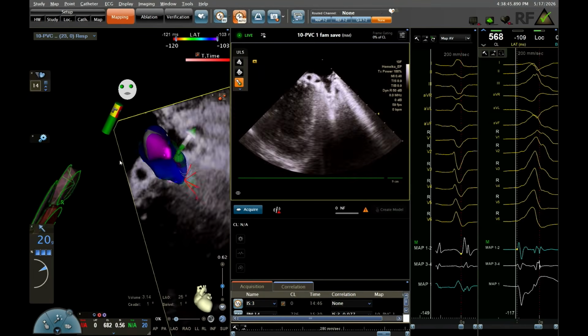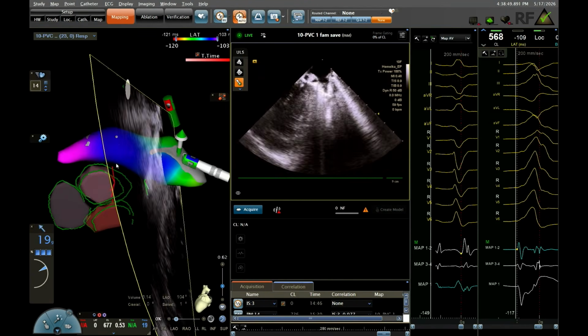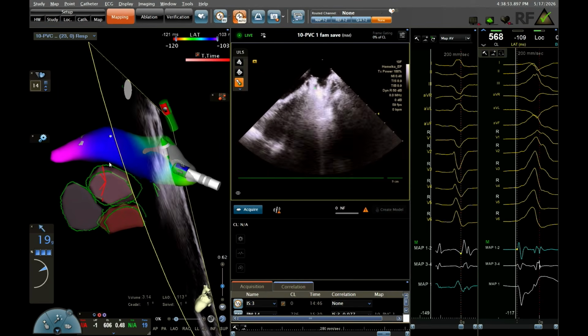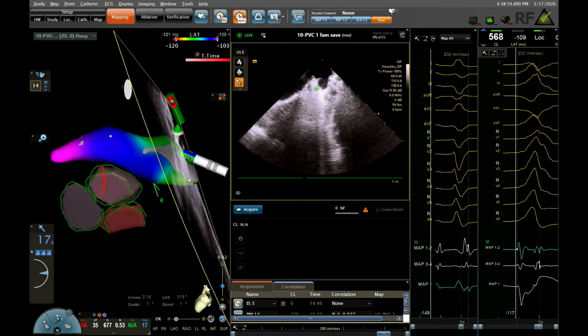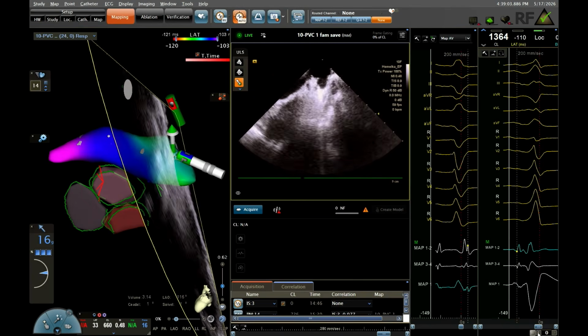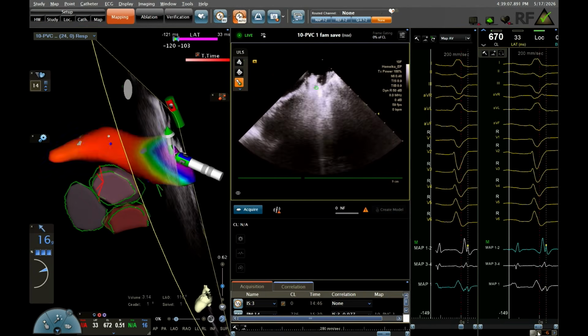Okay? Move it around so I can see where it is. Yeah, I'm too interior, so I'm going to come slowly. Once you caught the green marker, you see that? That's the green marker, and that's the circumflex. I can tell you we are almost a centimeter from the circumflex, surrounded by fat, in the epicardial aspect of the LV summit going to the base of the heart.